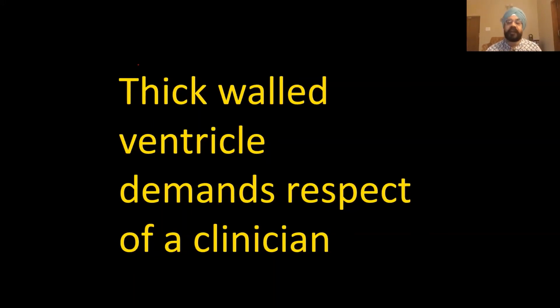So there have been a lot of questions. Let me read out a couple of them as I see them. Dr. Shilpa wanted to know that the non-compaction and abnormal trabeculation which you showed, are they different?